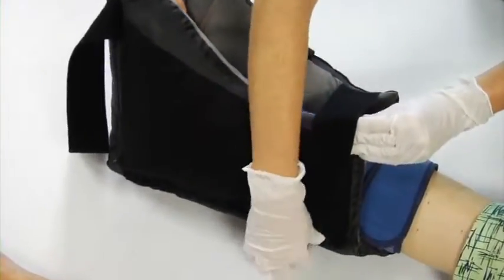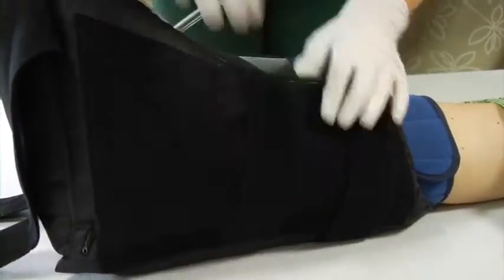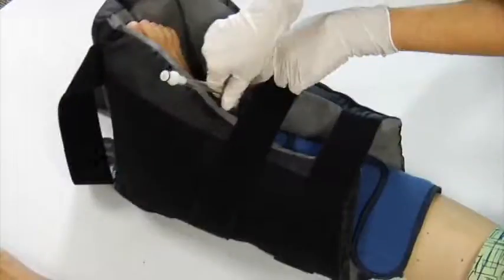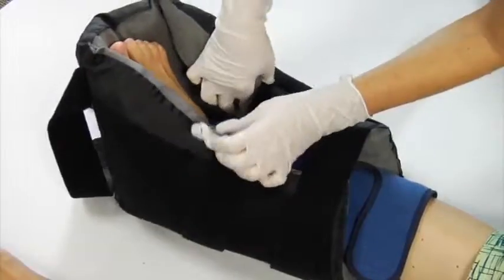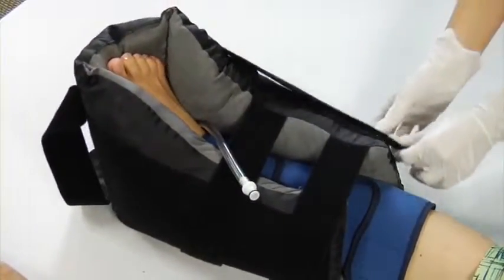The heelmedix works with most DVT compression devices. When the patient will be using both a DVT compression device and the heelmedix, position the tubing in between the straps. Make sure the tubing is not causing pressure or friction on the patient's skin.